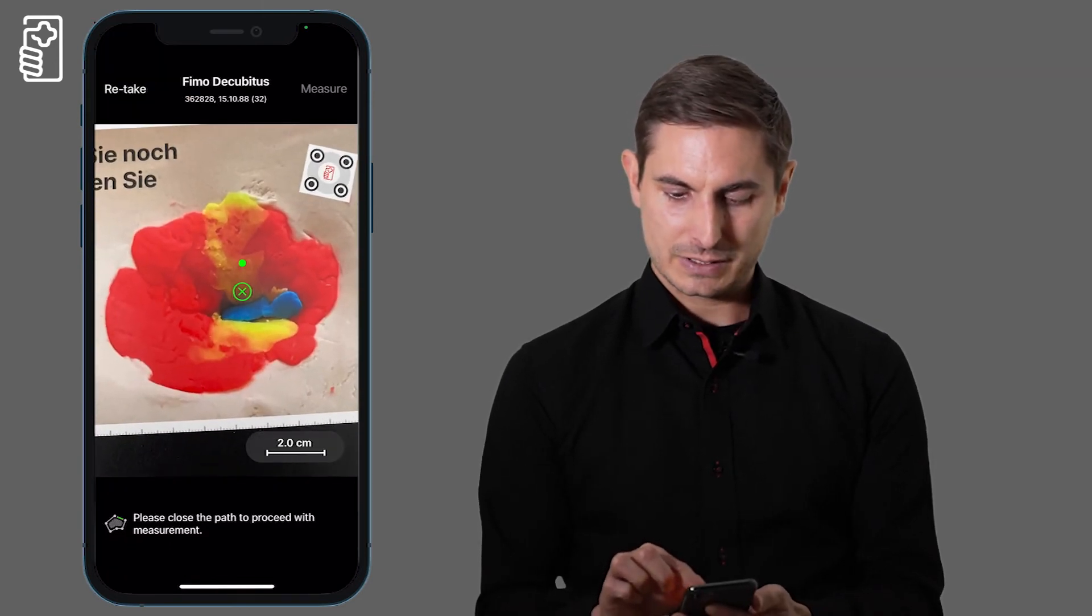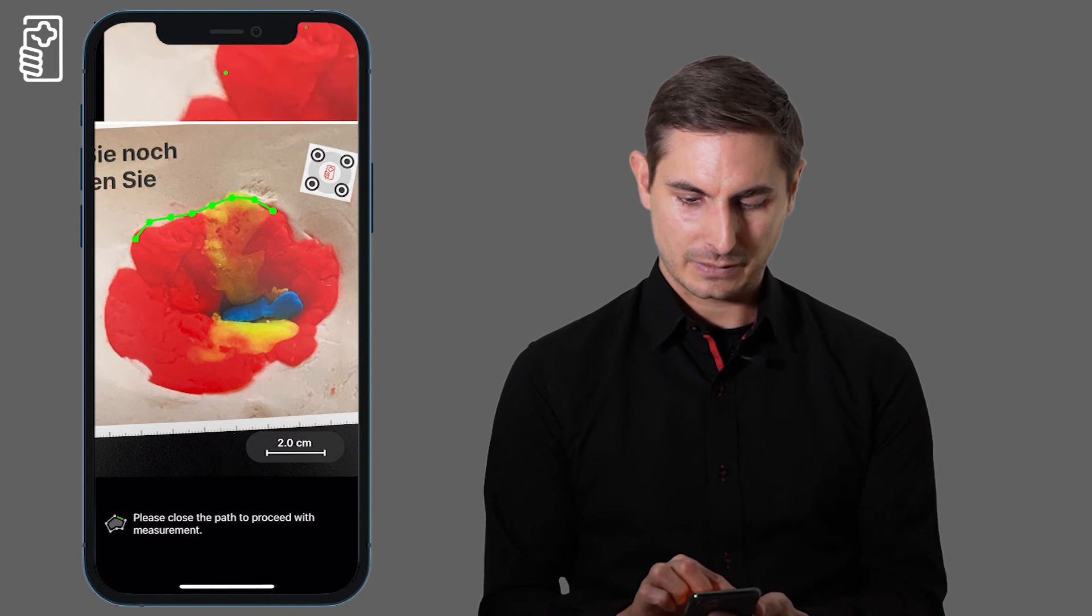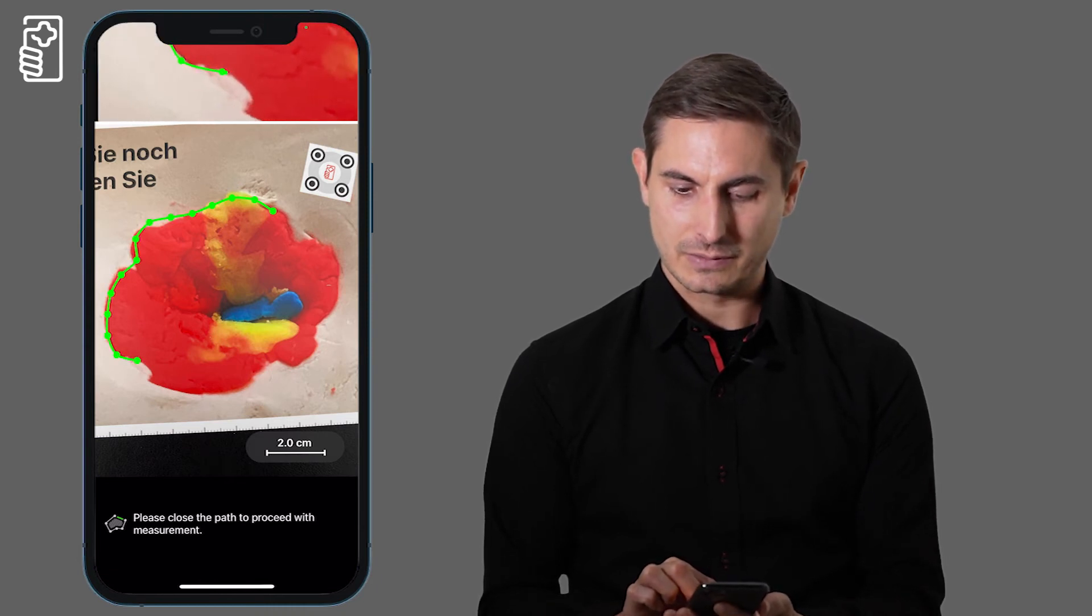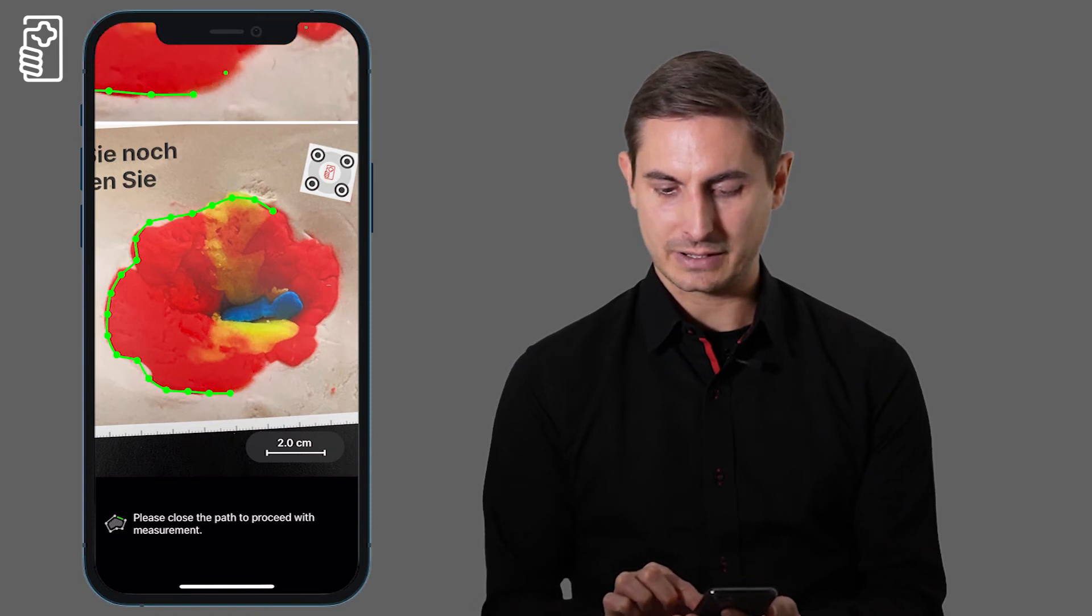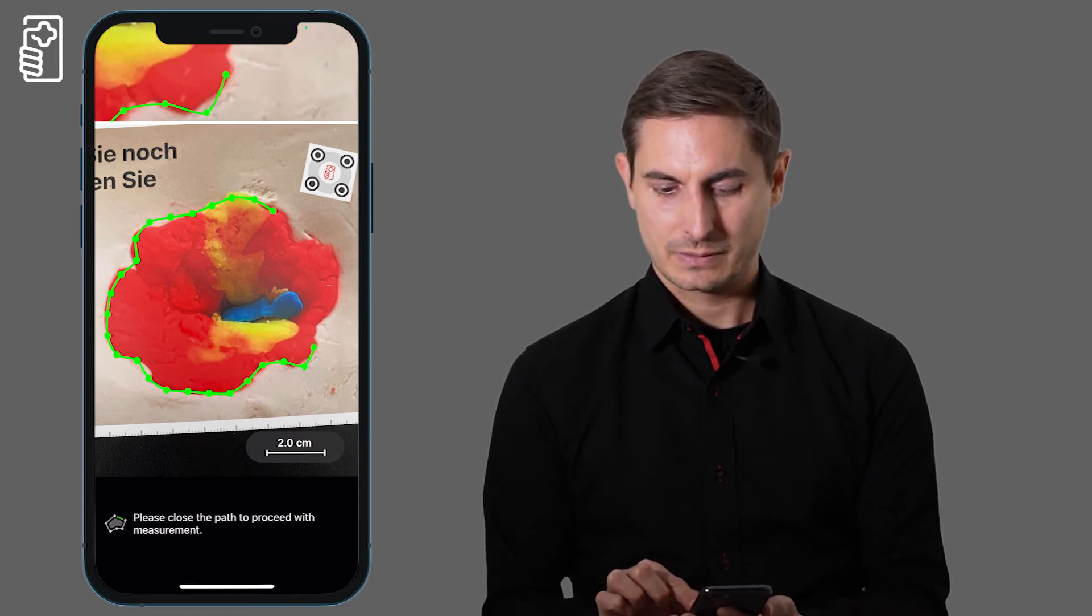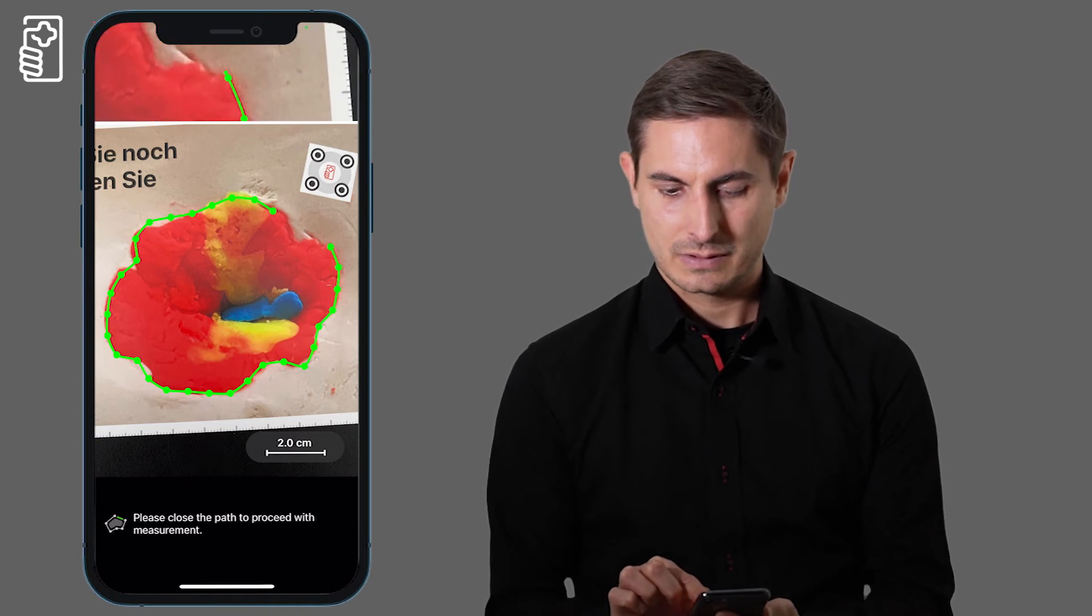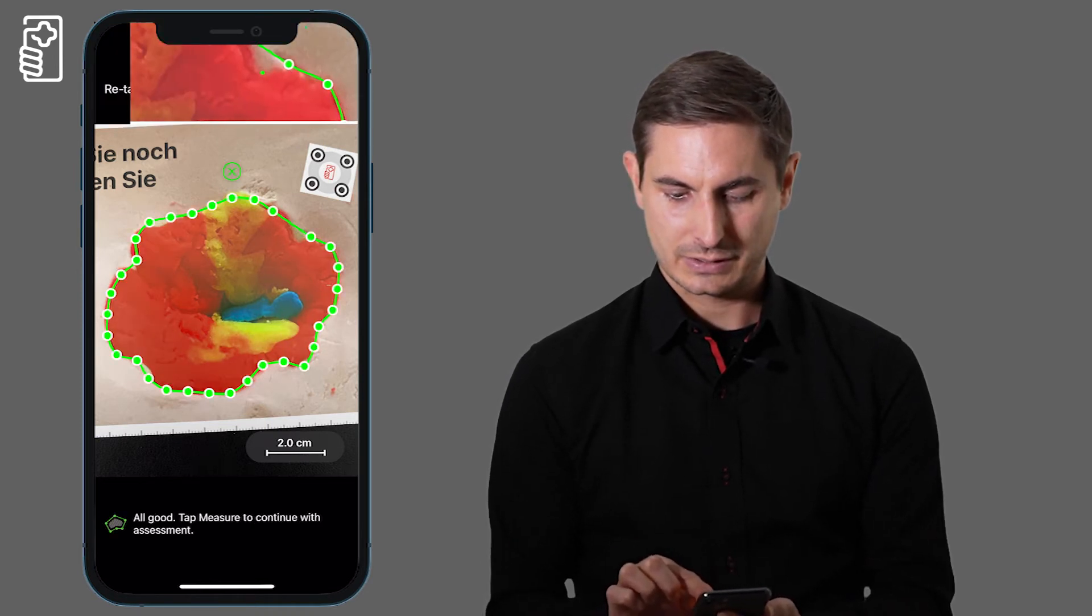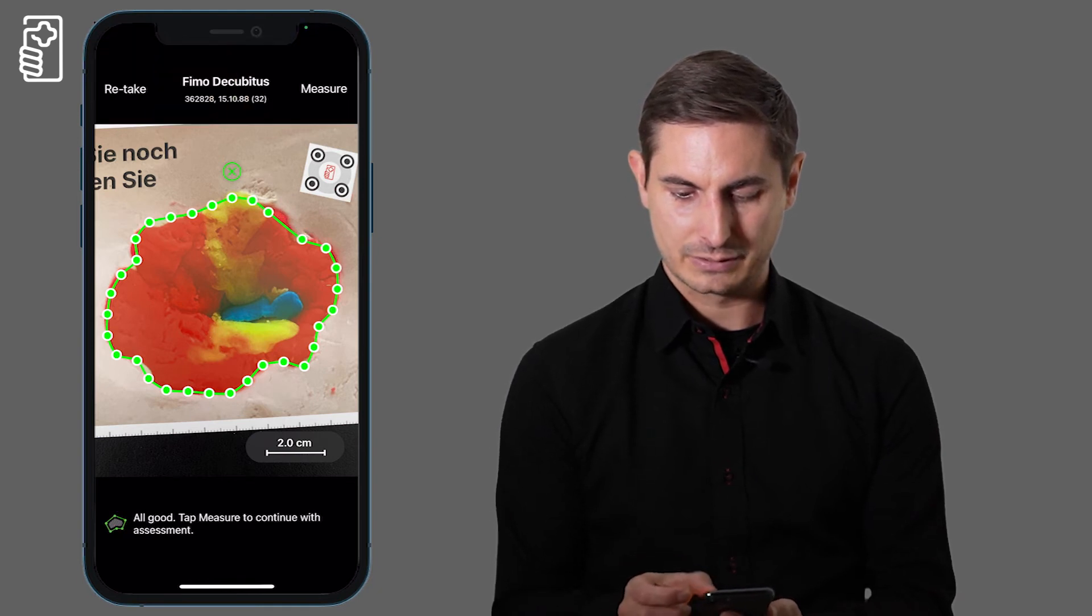I am now encircling the wound border with my finger and on the top you see a magnified area and if I want to adjust I can just tap the green dots.